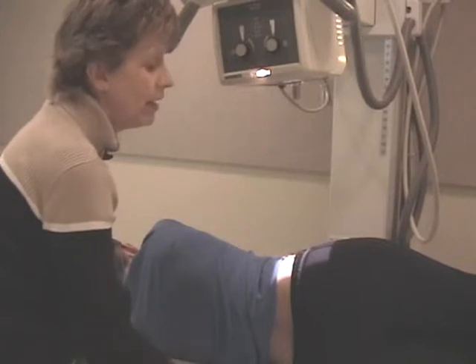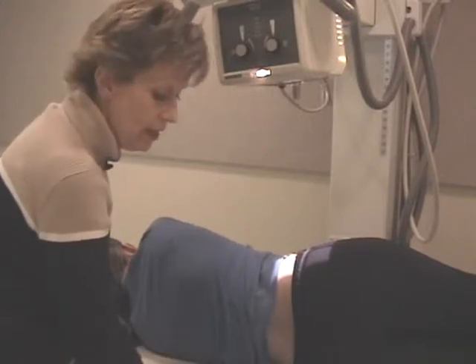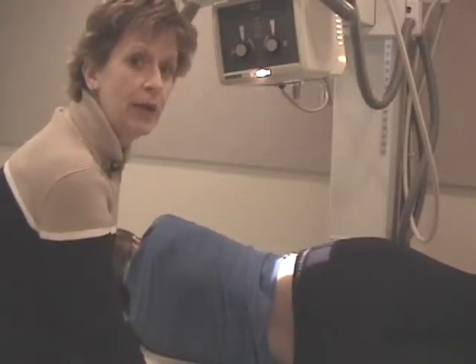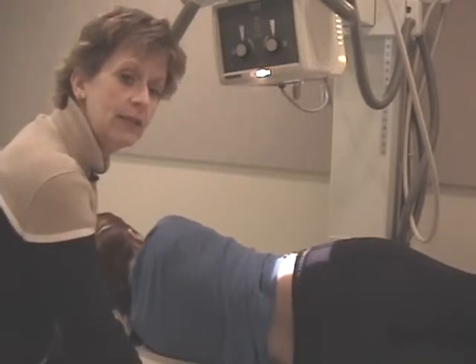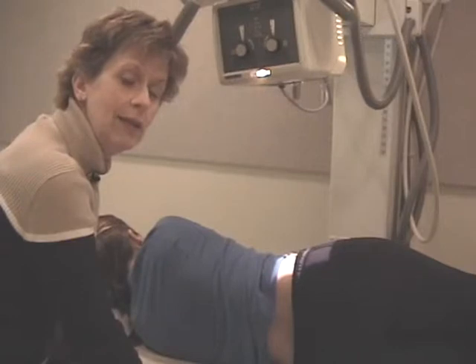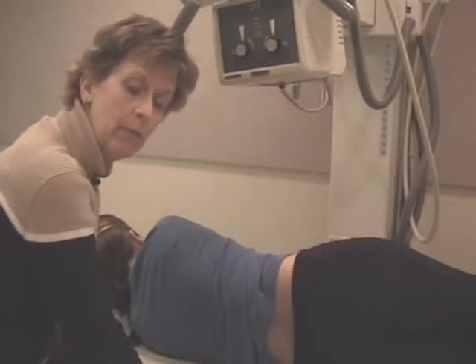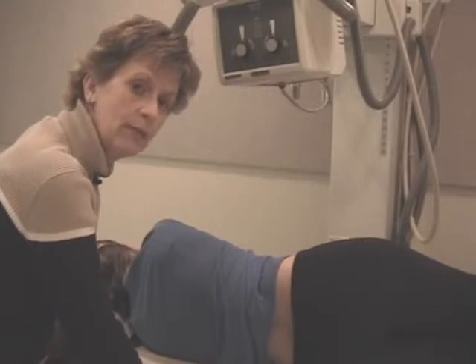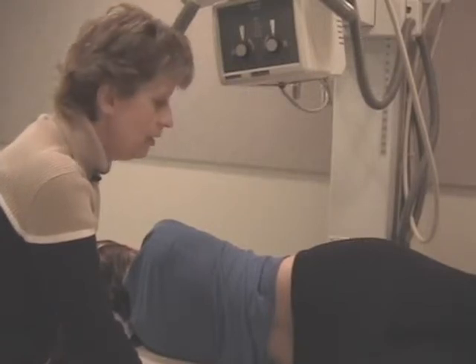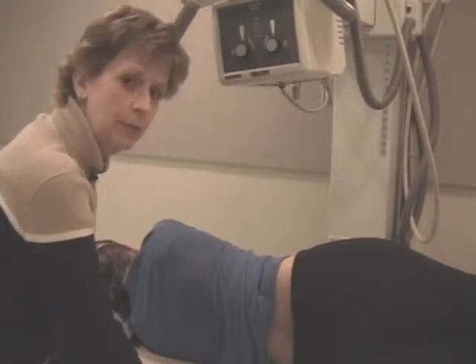Collimated field, I'm showing about an inch of collimation all the way around. I move my L marker in. I have a caudal tube angle on, 5 degrees. On some patients you might need 8 degrees, or you'd have to build them up with a sponge to make the spine parallel in order to open up that joint space. And this would be the lumbar spine series.